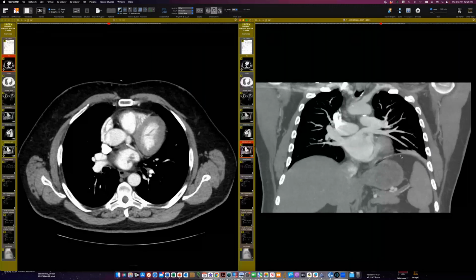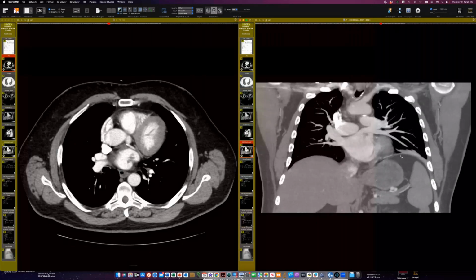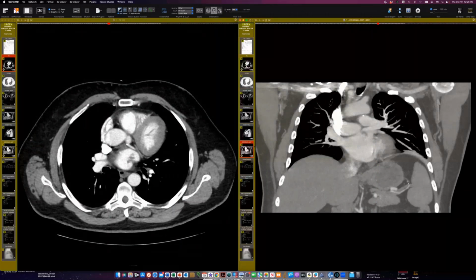So I haven't looked that up yet. Is that a familiar entity to you? This thing is bizarre. Yeah, that's in the differential. I mean, that's along the Coumadin ridge, right? So it definitely could be muscle, that does happen there.